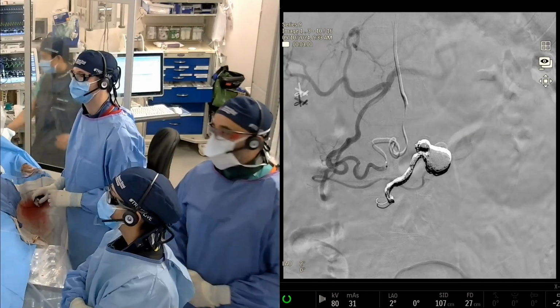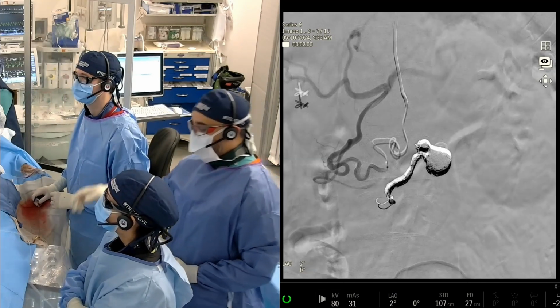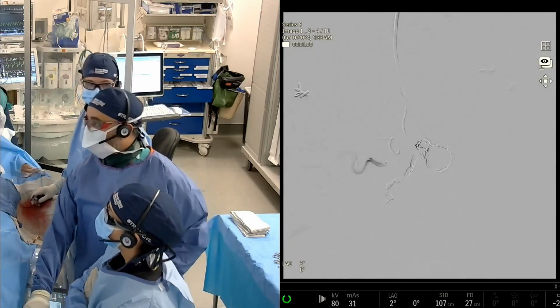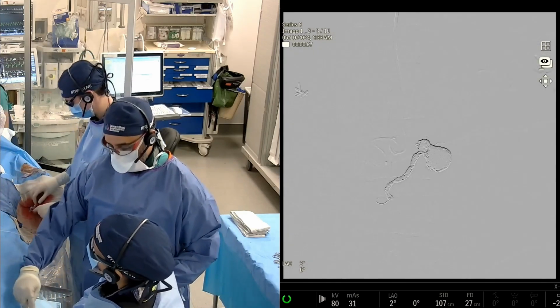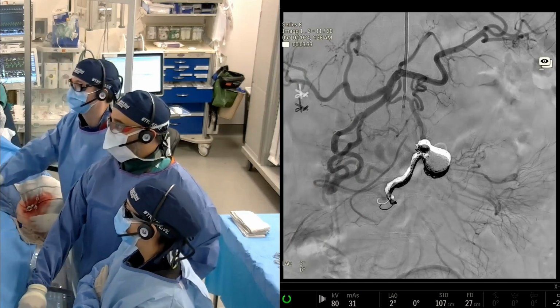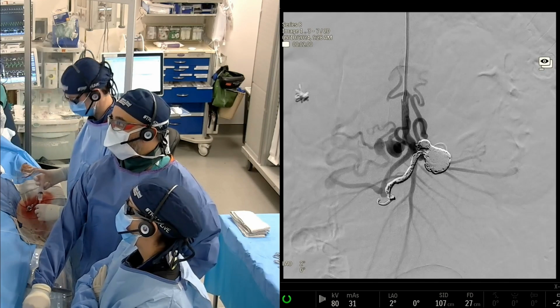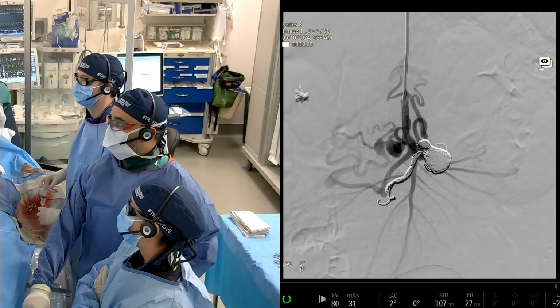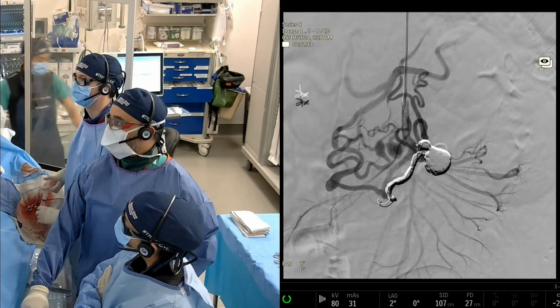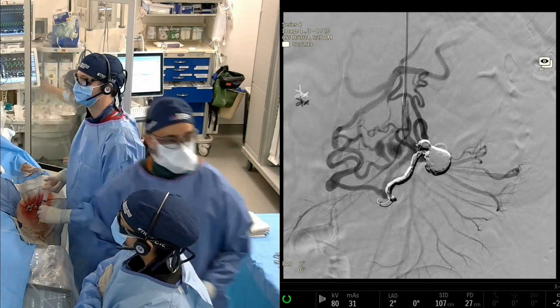Are you getting nervous though about taking out the second source of supply to the liver? Just out of curiosity. I'm not. If you go back, Aaron pointed out that very robust, more medial pancreatic duodenal. You can see the alternate pathway on this angio actually. You can see the gastroepiploic here, the GDA, and the one that goes straight up and connects right in between the aneurysm and the coils. Yeah, exactly. So I'm not terribly worried here.